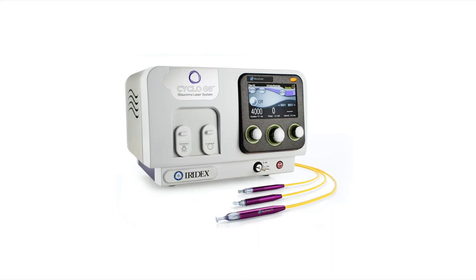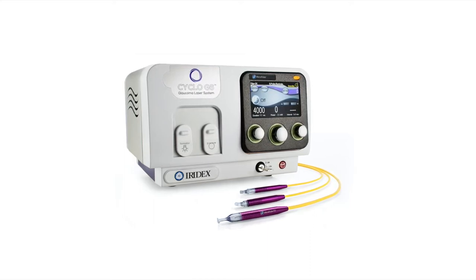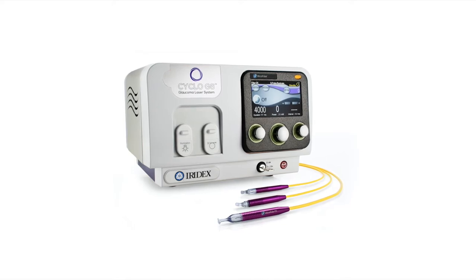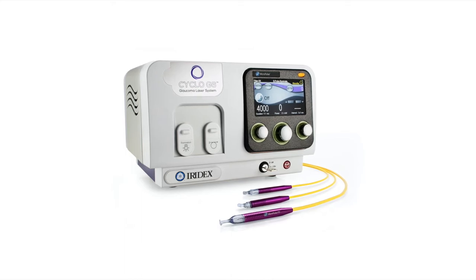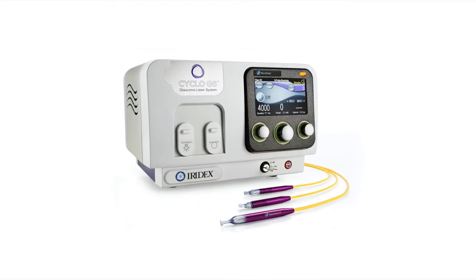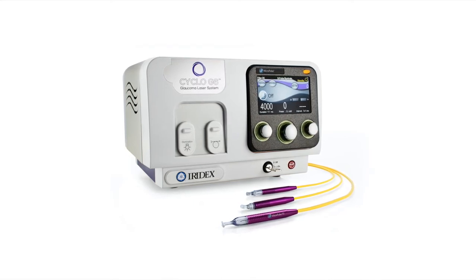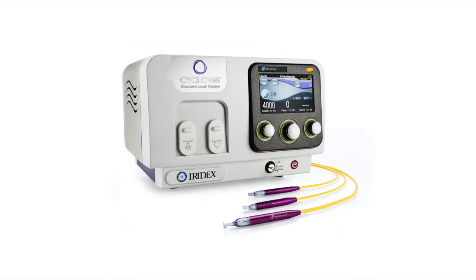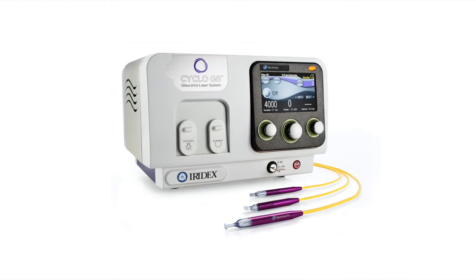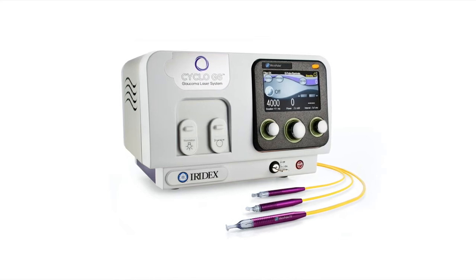Welcome to the Iridex Cyclo G6 setup, initiation, and walkthrough. The Iridex Cyclo G6 laser platform is an 810 nanometer diode laser for the treatment of glaucoma. If you have a unit capable of indirect ophthalmoscopy delivery, you can also treat retinopathy of prematurity and some rare ocular tumors.